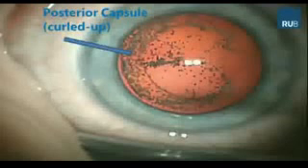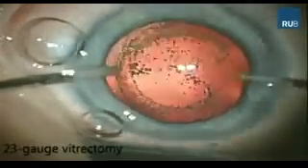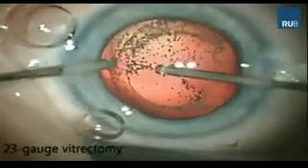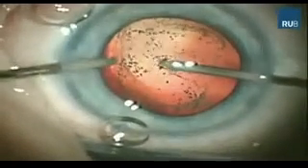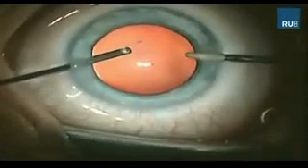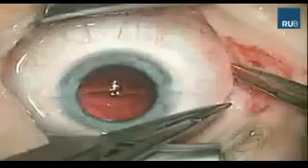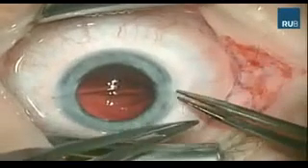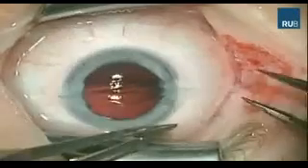In this case, the laser posterior capsule was already curled and moved to the lateral side. A minimal 23 gauge anterior vitrectomy is performed and is made easier by the small gas bubbles from the femtosecond laser cavitation within the anterior vitreous. The paracenteses are sutured using nylon 11.0, and the lateral lid opening is also closed by a buried resorbing suture. We decided not to implant an IOL because of the very young age of the patient.